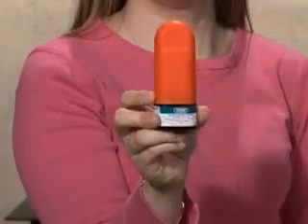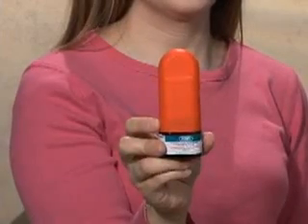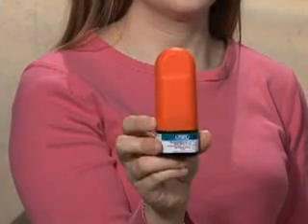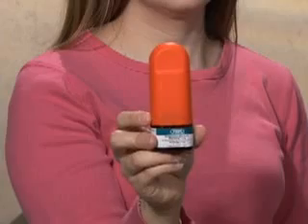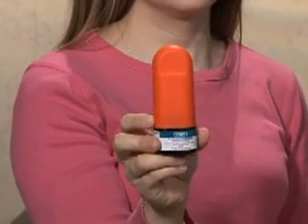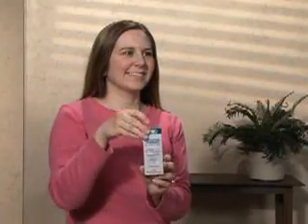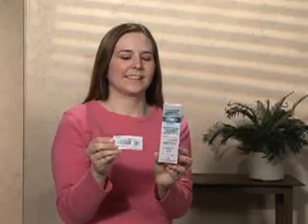Replace the cap on the inhaler for storage until the next time you need it. Just a reminder, you only need to prime the inhaler before its first use or if you haven't used the inhaler for two weeks or more, not between each use. Please refer to the patient package insert for specific re-priming guidelines for each product.